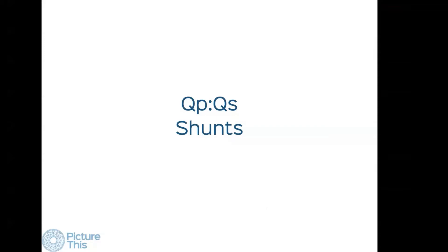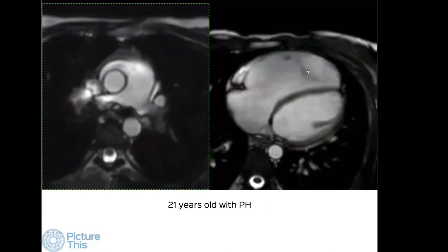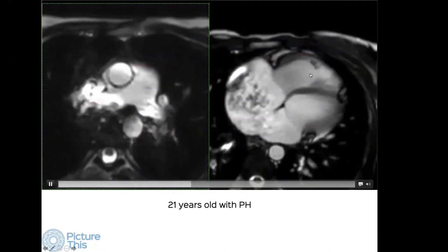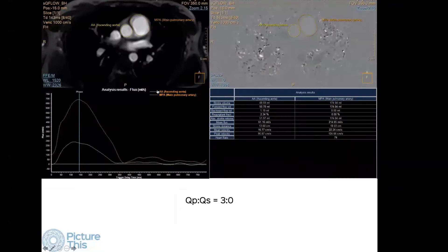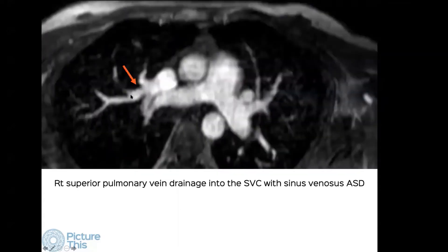We can also measure QP/QS. Here is a 21-year-old with pulmonary hypertension — on the four-chamber view you can see the RV is markedly dilated. The MPA is also dilated. Measuring flow at the same level in the ascending aorta and pulmonary artery, the absolute stroke volume is three times greater in the pulmonary artery, giving a QP/QS of three. We found anomalous drainage of the right superior pulmonary vein into the superior vena cava with a sinus venosus ASD, confirming the cause of pulmonary hypertension.